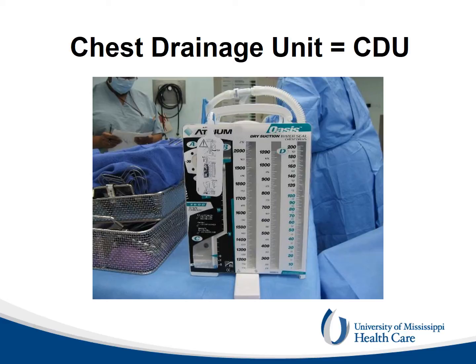Also visible on the top of the CDU is the inline connector and the blue sliding clamp. When changing CDU or taking a sample of the drainage is necessary, always clamp the tube on the patient's side before disconnecting the inline connector, then reconnect with an audible click and reopen the sliding clamp.